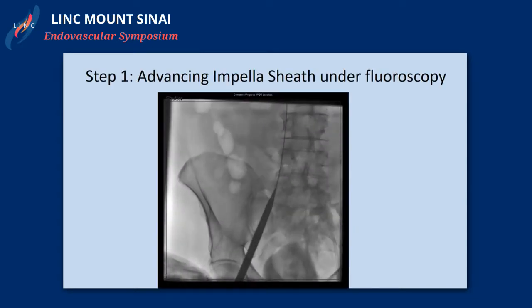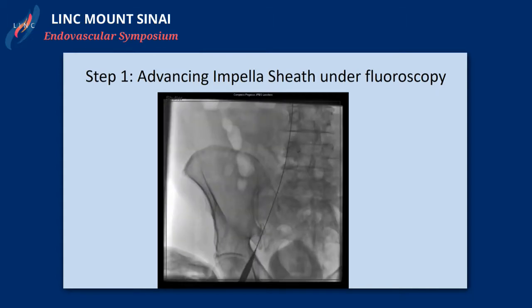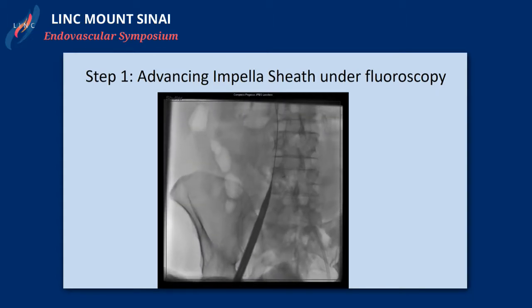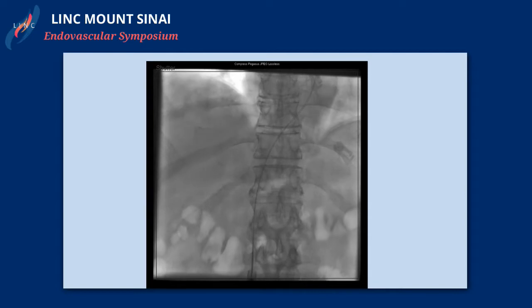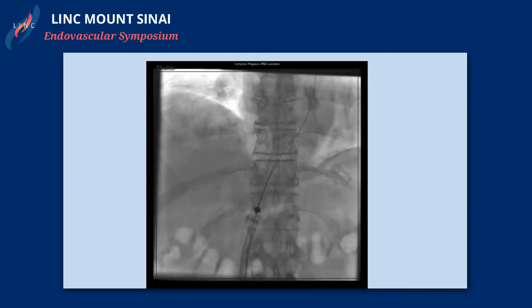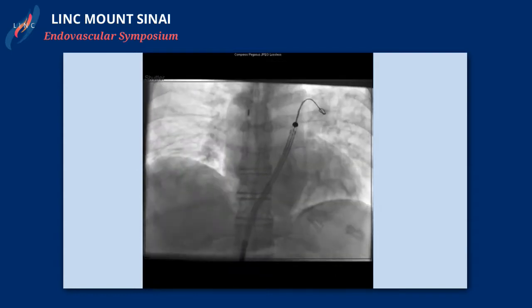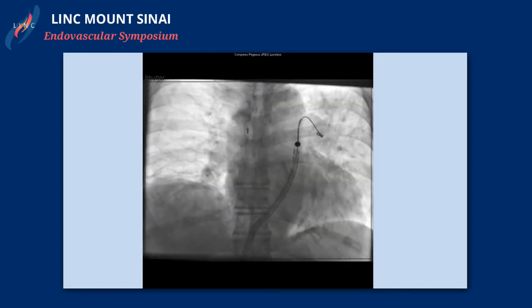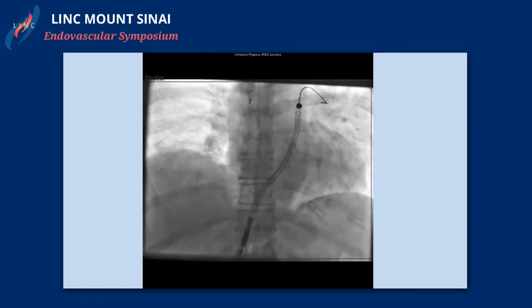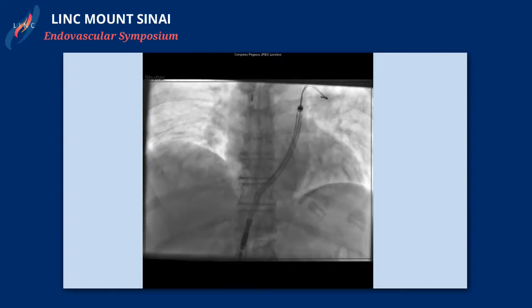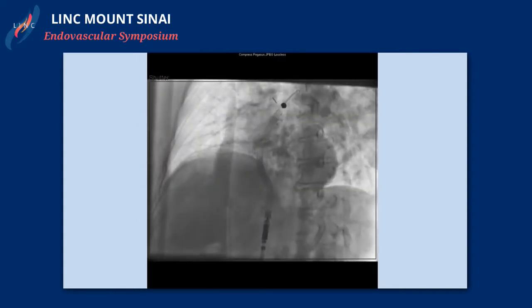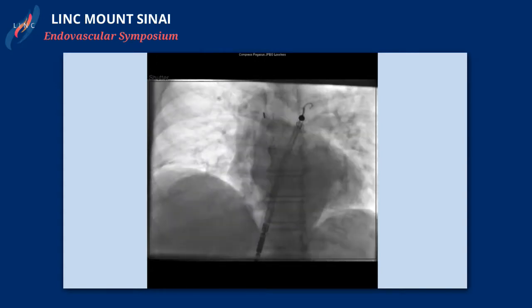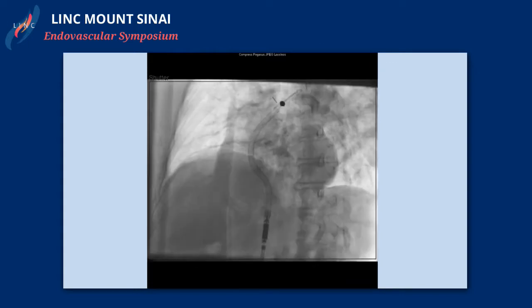This is the large-bore sheath entering the venous system — though we have more flexibility in the venous compared to the arterial system. Here's the device coming out of the sheath and entering the right atrium. We use a wire placed in the left pulmonary artery to anchor, then pull it out, and the end of the device is almost pigtail-like. In the panoramic view, you can see the device going anterior, then up and over into the pulmonary artery.